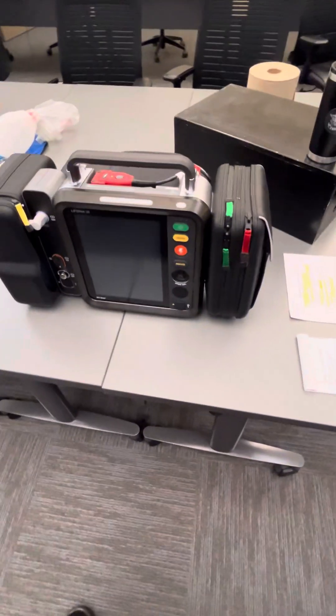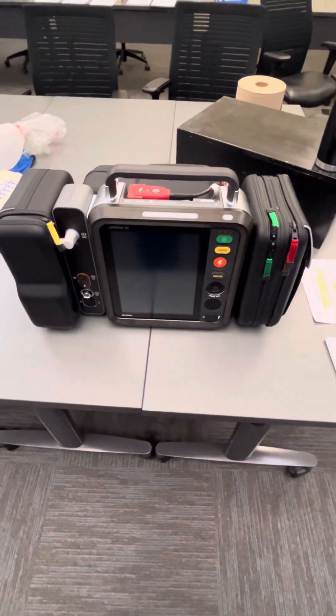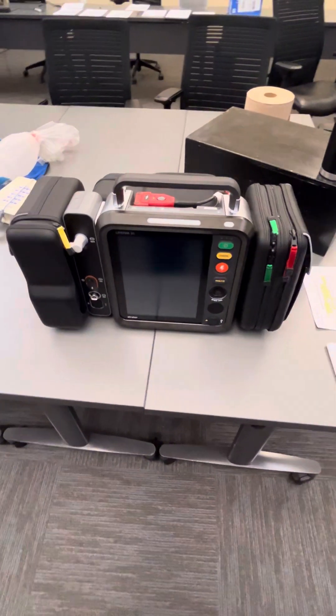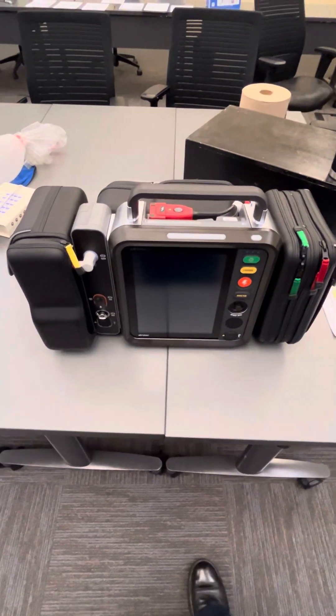Good afternoon. This is Lieutenant Townsend with Fayette County Fire and Emergency Services. Today we're going to be talking about the LifePak 35. This will be a multi-video series talking about the different parts and functions. In this first video we're going to start by talking about the outside.